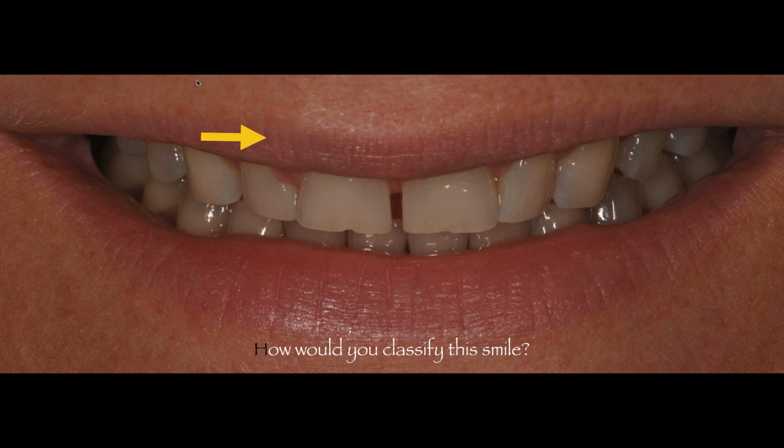And if you look at this photo, we can all agree that this patient has a medium, average smile line, but we can see as well that the papilla between 7 and 8 is hypertrophic compared to the papilla between 9 and 10. So the anatomy or the shape of both of these papillas is different.